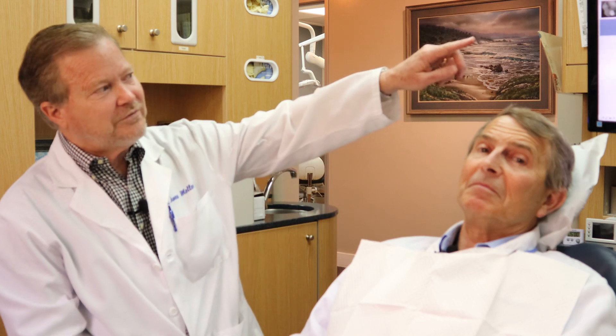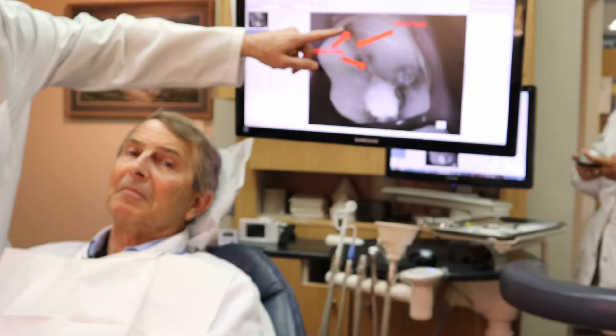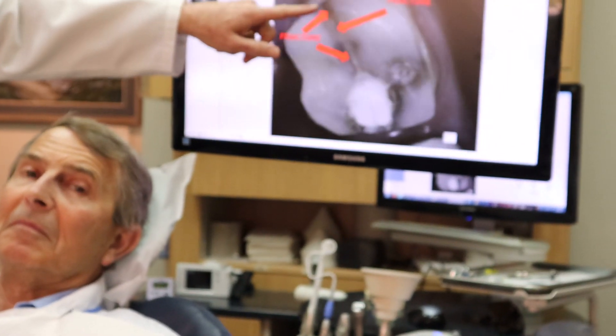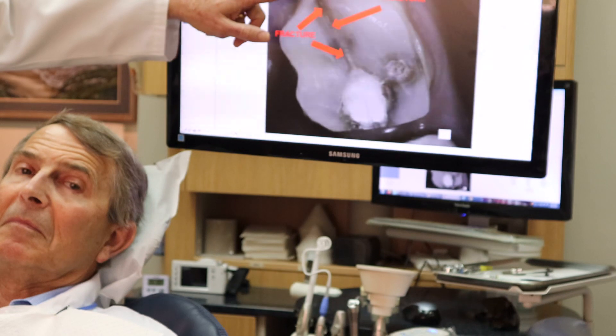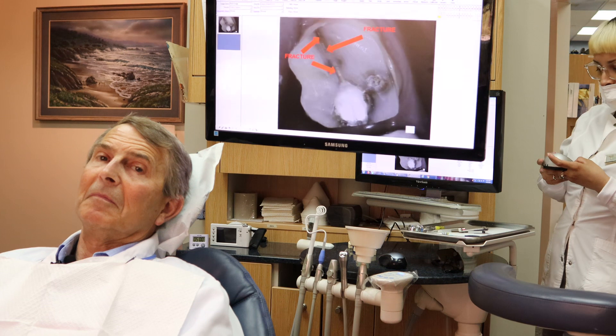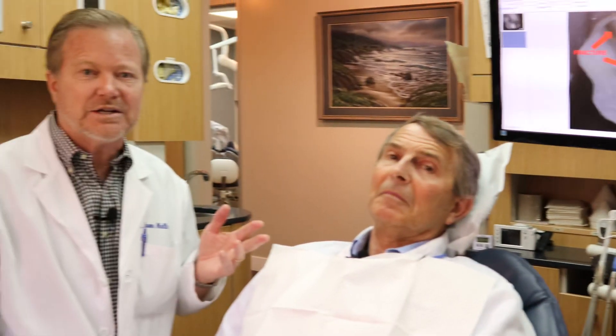So when I prepared the tooth for a crown, I want to show you the photo that we took, which demonstrates the fracture running across the entire biting surface of this prepared tooth. It even goes down the backside of the tooth. If this tooth was not treated with a crown, it would literally split in half, which would require extraction.